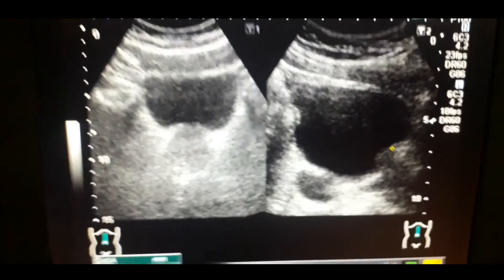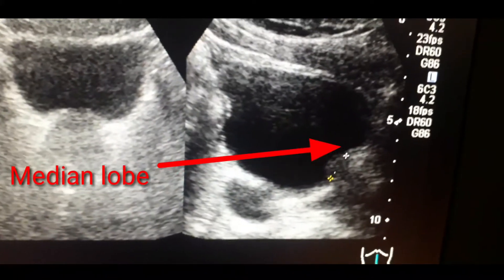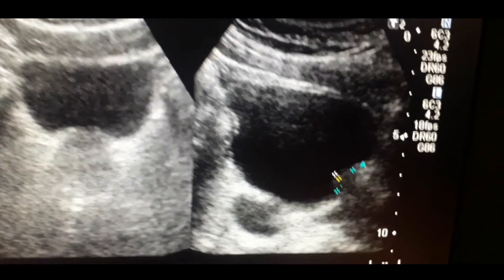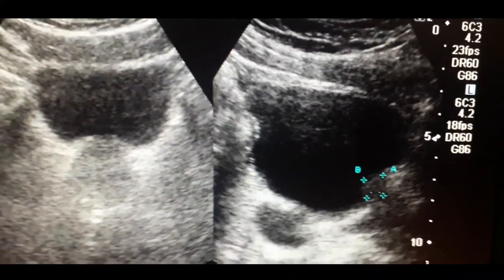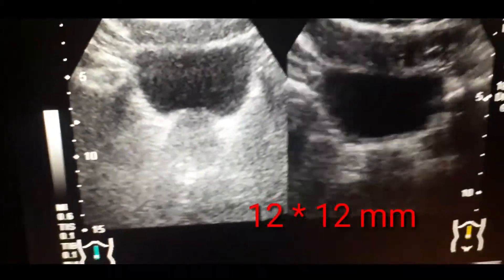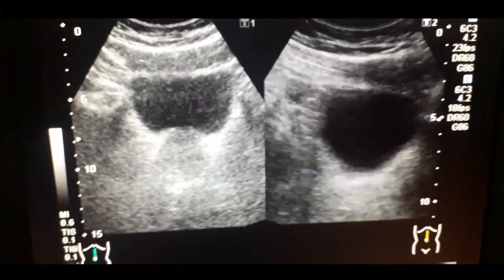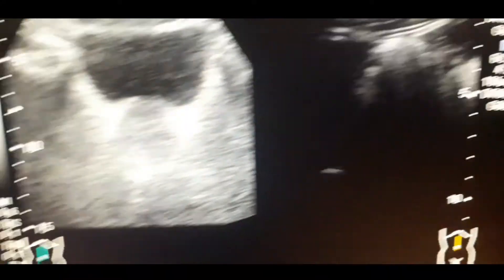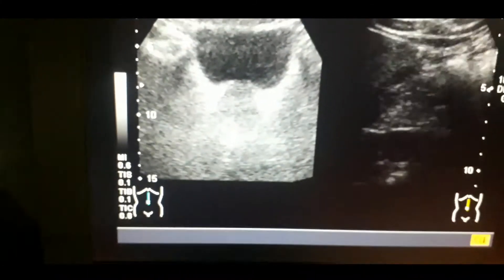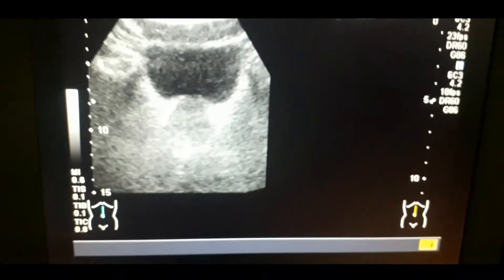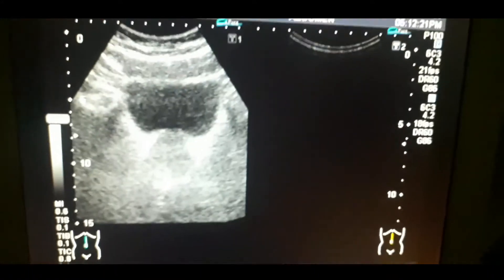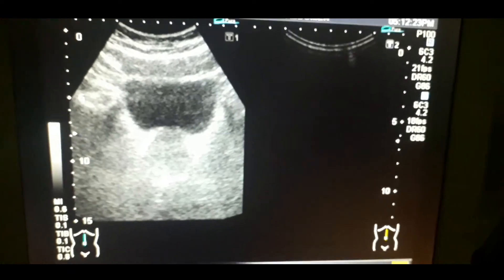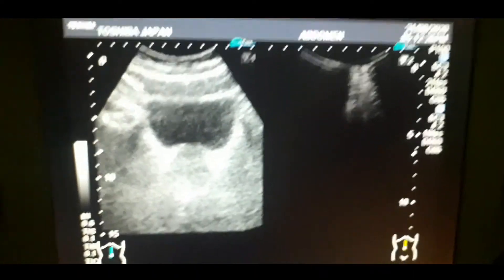Now you can also see the median lobe of the prostate that is projecting inside the bladder. You can also calculate its size — it is about 12 x 12 mm. This median lobe also causes lower urinary tract symptoms in the male. This is a very classical case of BPH with an enlarged median lobe.